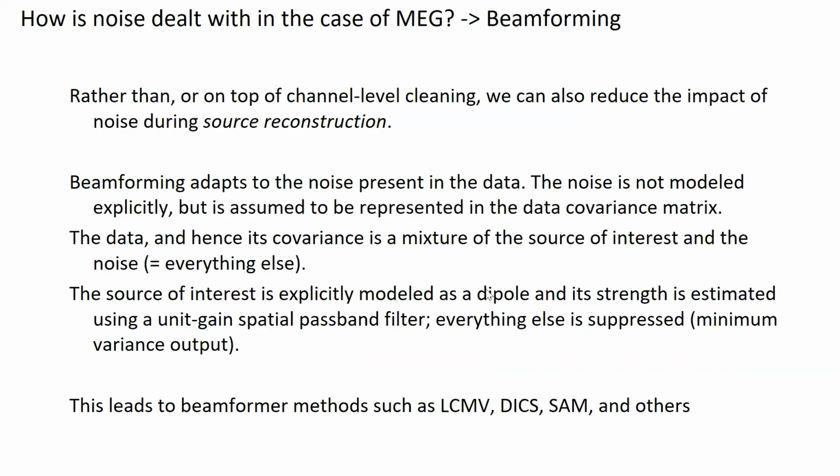Besides doing channel level cleaning, it's also important to consider that since MEG has a very high spatial resolution, we're often doing recordings to reconstruct activity on the cortical level. And we can reduce the impact of the noise during the source reconstruction. And beamforming is one of these techniques that explicitly makes a separation between the signal of interest from a region of interest and the noise. So beamforming adapts to the noise present in the data.